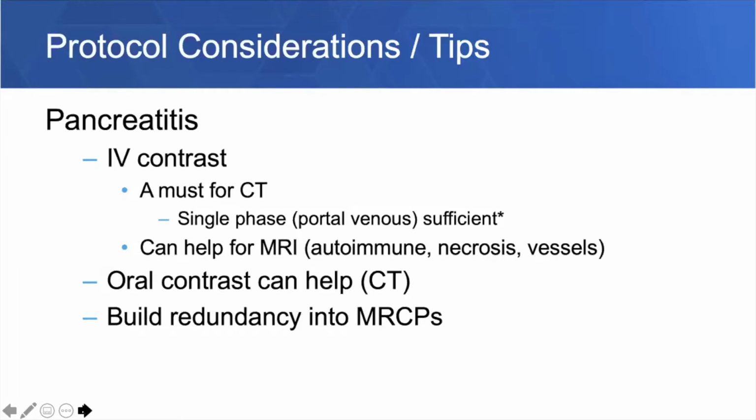With regard to oral contrast, we basically never use oral contrast for MRI for pancreatitis. It's a plus or minus when it comes to CT. Sometimes it can be helpful to separate fluid collections from bowel loops. So it can be helpful in that context.